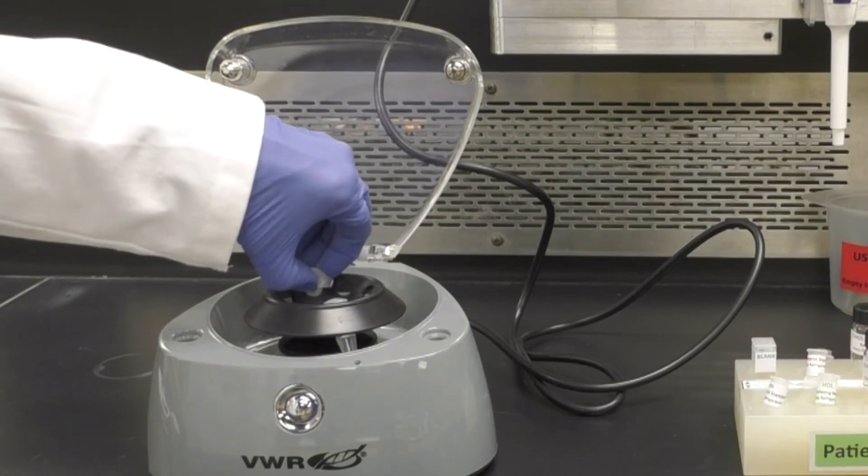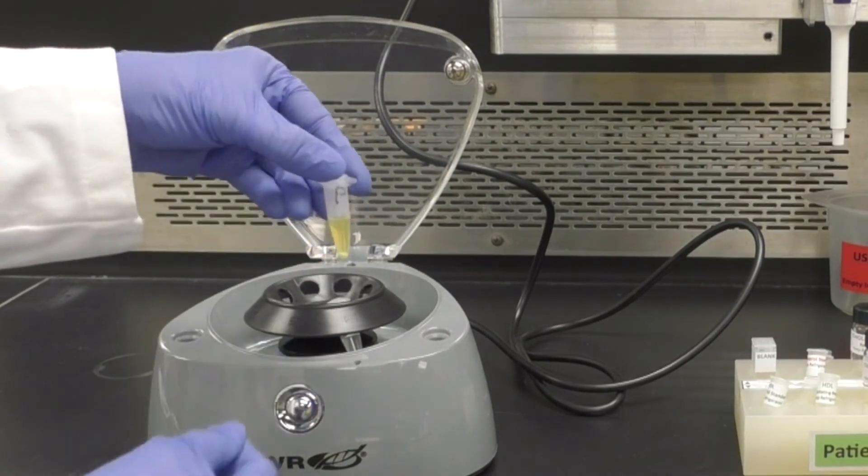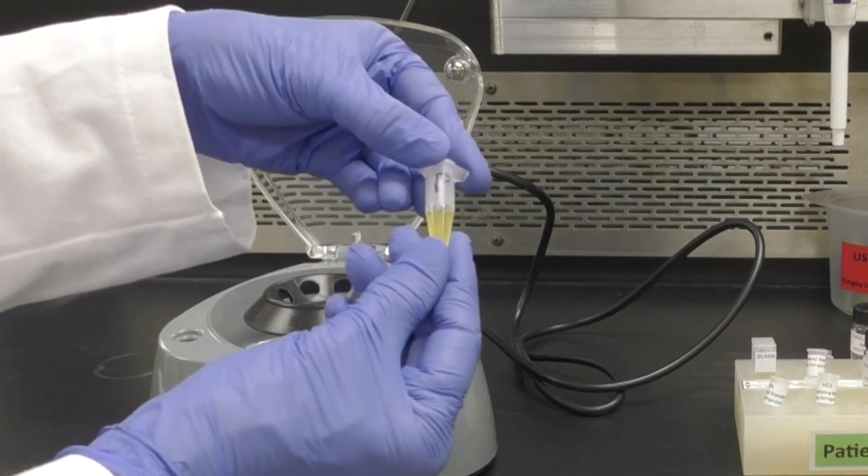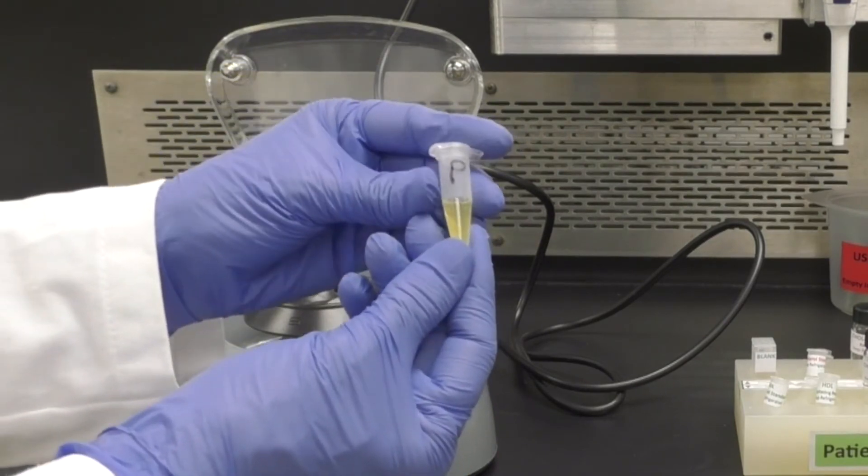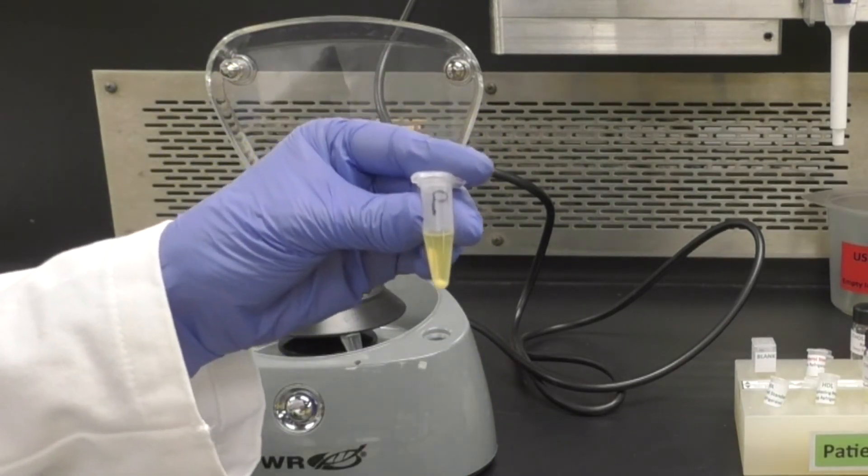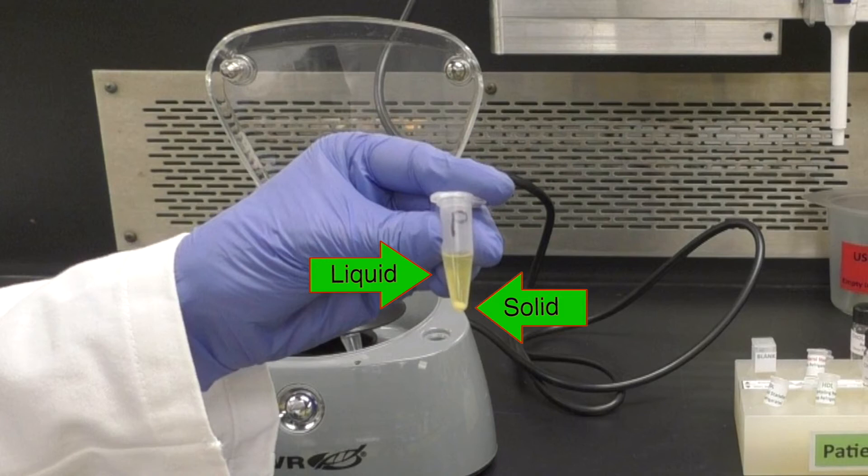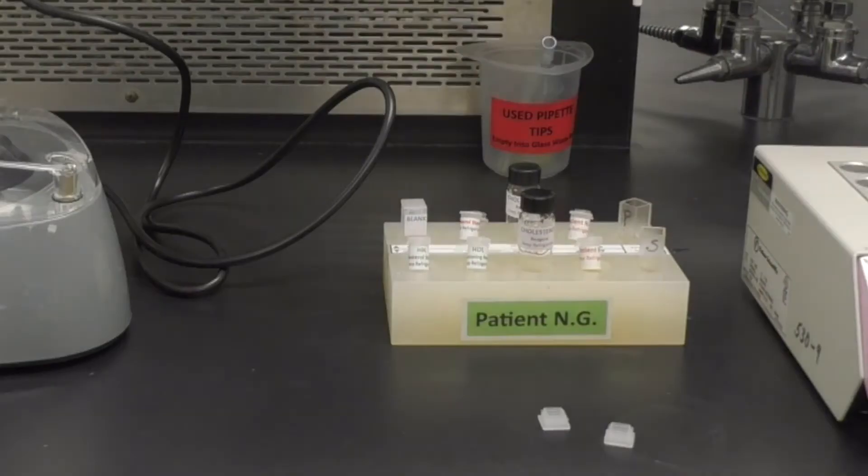Carefully remove your patient sample, taking care not to remix the contents. You should see a solid at the bottom of the tube and a light yellow liquid which contains just the HDL cholesterol above that. Remember to remove the balance tube also.